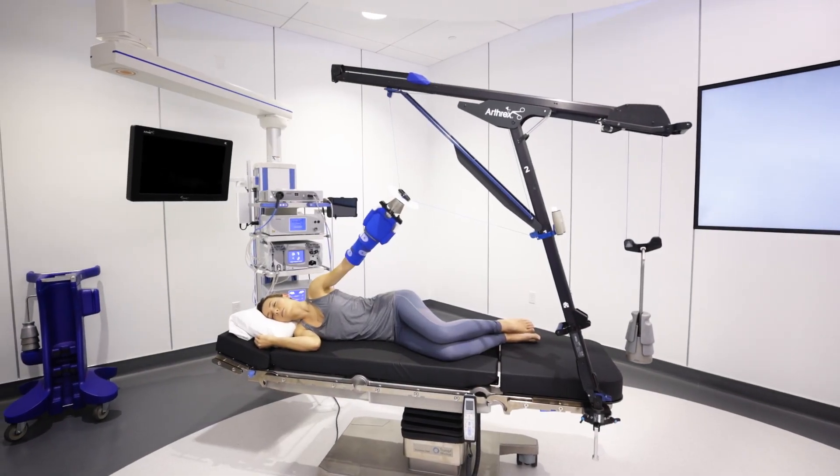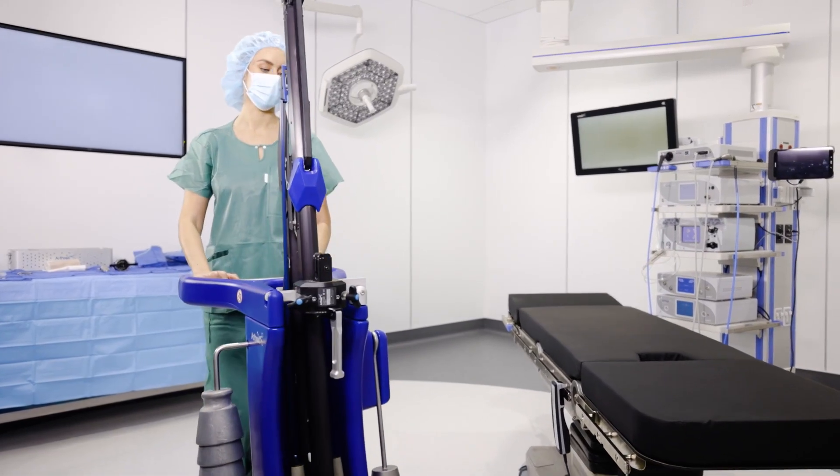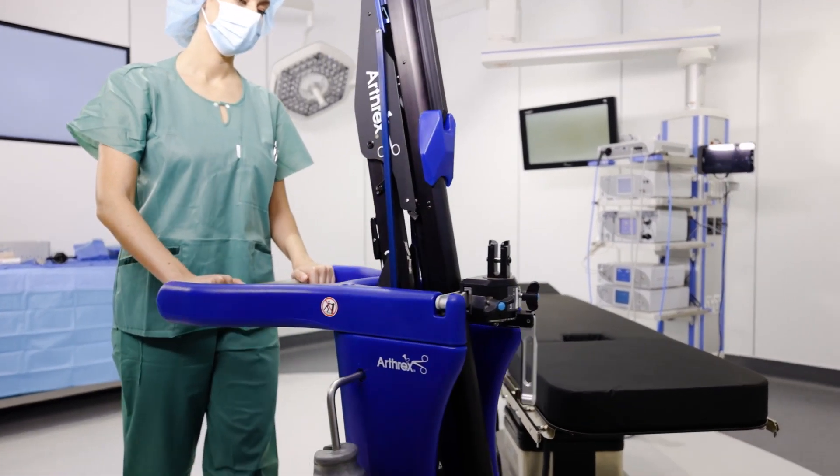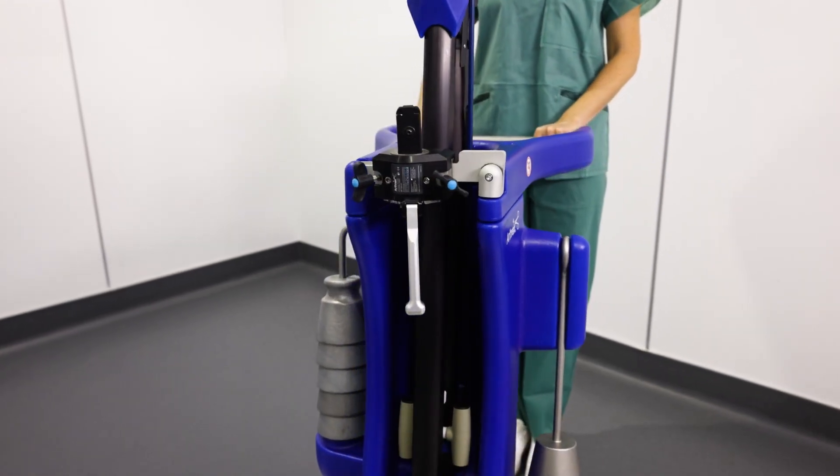The Arthric shoulder suspension system for lateral decubitus positioning combines a simple design with intuitive functionality while providing surgeons with optimal visualization during arthroscopic shoulder procedures.